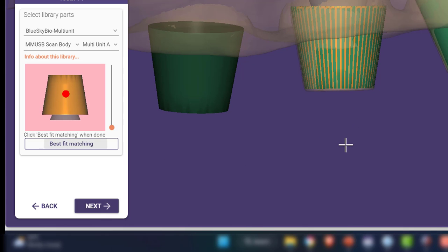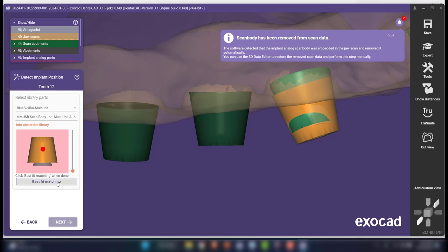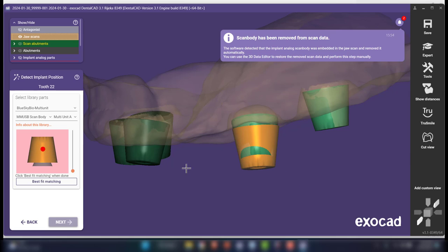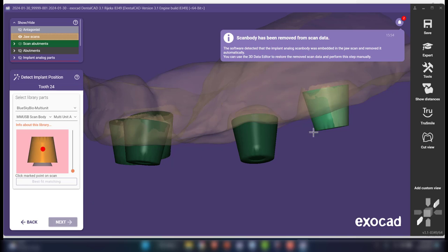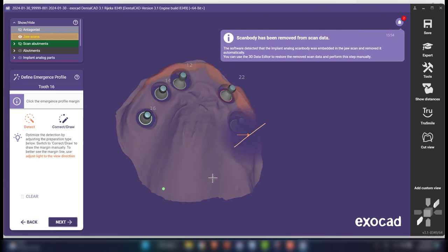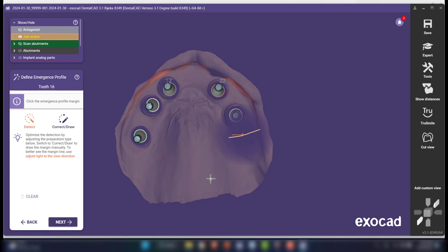We'll click the next one, best fit match it. And this goes really quick. All right, we'll do our last two. And here's the last one. All right, so now we've got all of our multi-units indicated, and they're extremely accurate to one another. So we're going to be able to design a restoration that should be as passive as we can possibly perceive. It's about as good as anything we could possibly get in dentistry.